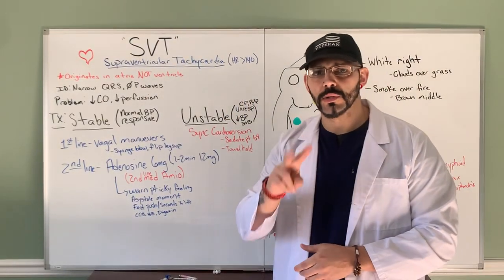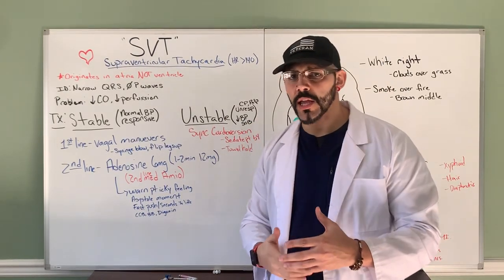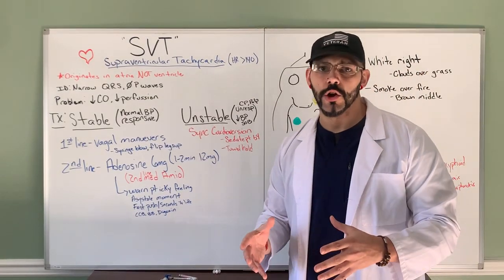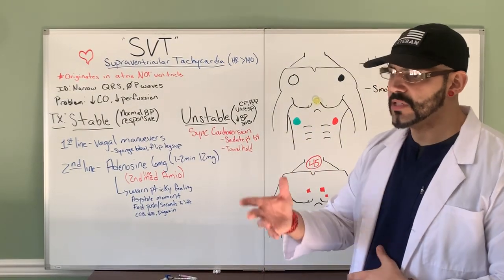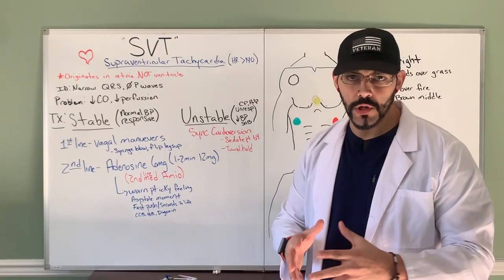Today I want to go over two topics, SVT and lead placement when you put a patient on a monitor or EKG, right? So let's start off with SVT, Supraventricular Tachycardia, all right? Now what is that? The heart is beating way too fast. Now some books you read may say 120, others may say 140, 150, but for your critical care exams, you want to know 140, okay?